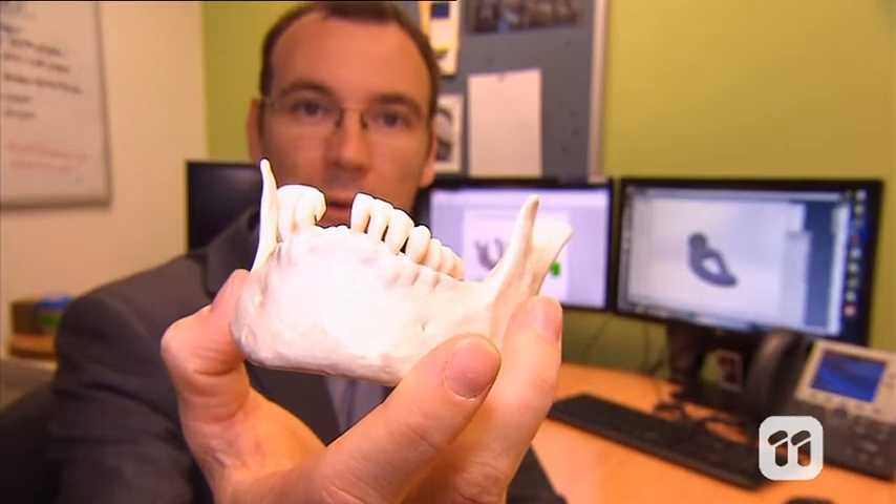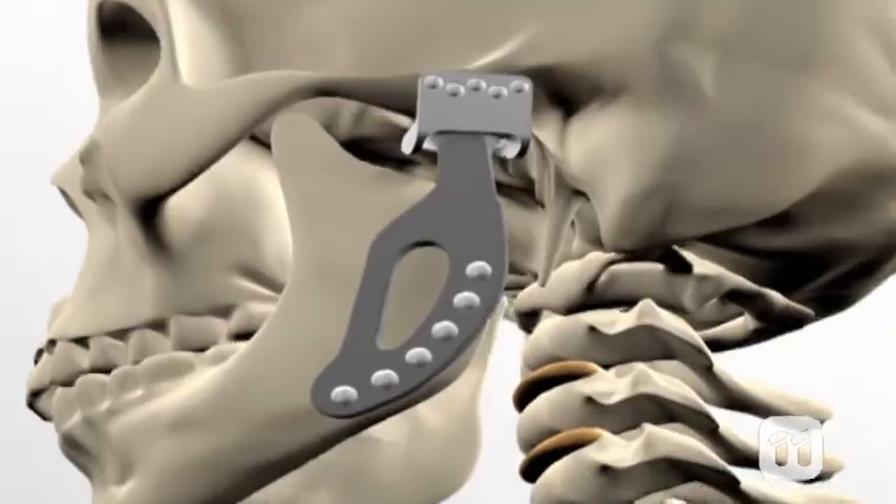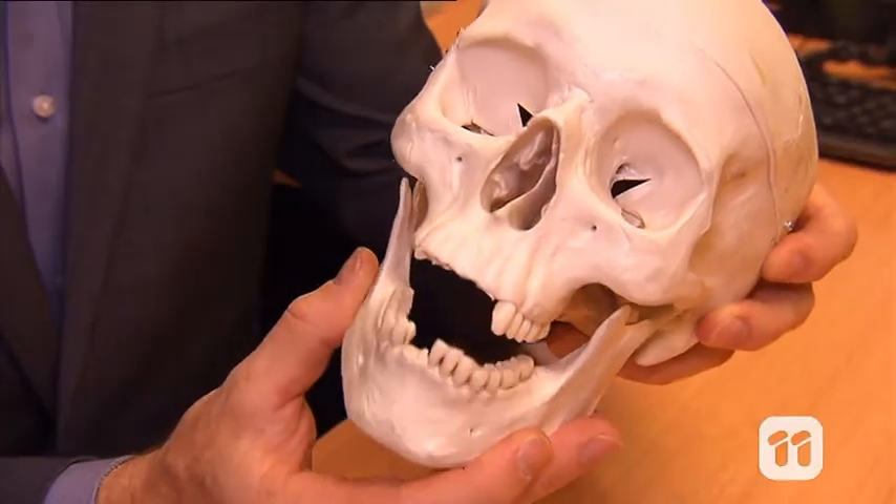In the future we hope to be able to 3D print an entire mandible. We would need to be able to attach teeth as well as the muscles. The finished product will mean the patient is able to talk and eat much more comfortably again. Right Murray? Right David.